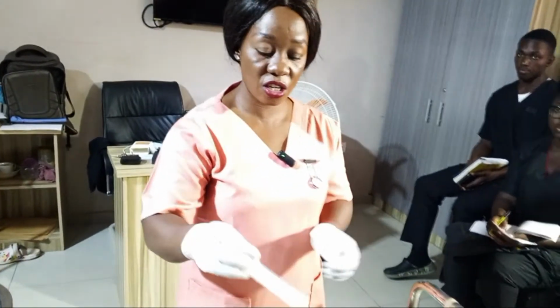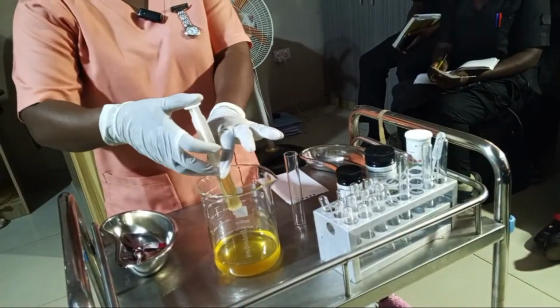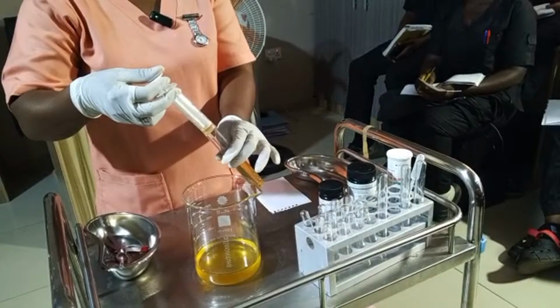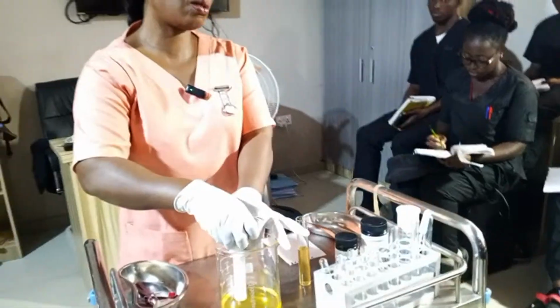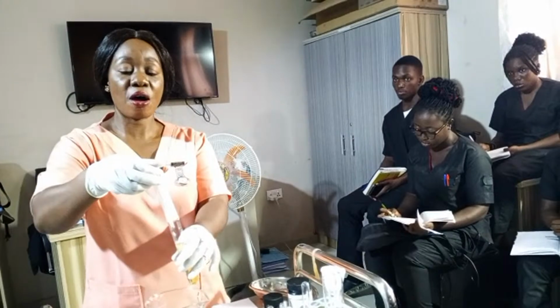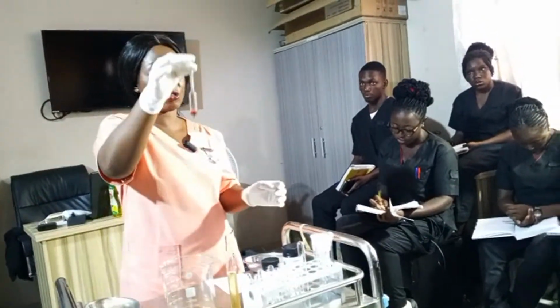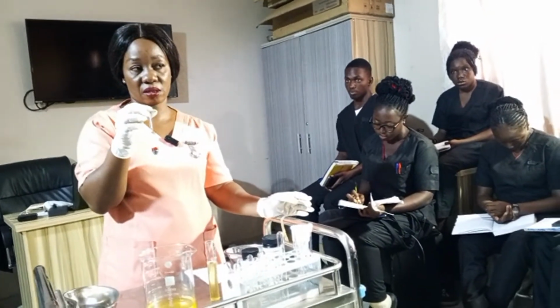So you can use the syringe to withdraw the amount of urine that you want and put it inside the test tube. Remember, for specific gravity, you don't have to fill up the test tube. Put it halfway because you are going to use urinometer to know the specific gravity of this urine, right?